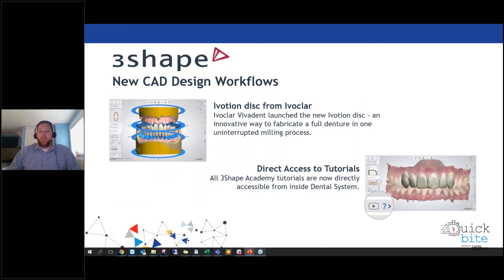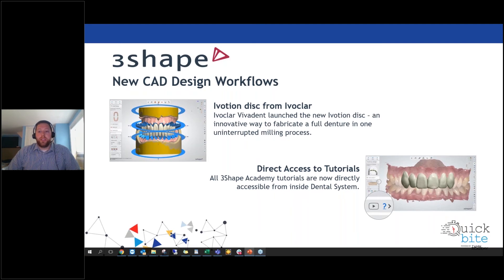Additional new CAD designs include the Ivotion disc from Ivoclar Vivadent, a new digital dentures workflow. Ivotion uses a unique 3D database tool with dental arch geometry in the disc and combines teeth and base material in one bi-color disc to deliver an efficient monolithic digital denture solution. The finished dentures only need to be polished after milling before going straight to delivery. With Dental System 2020, users can design these dentures and accurately place them within the disc — exclusively available with 3Shape Dental System.